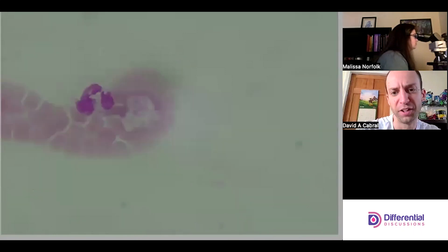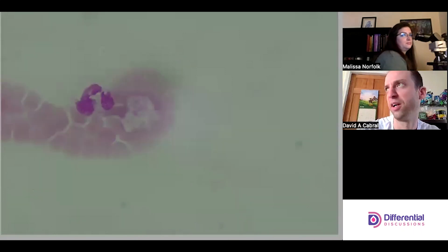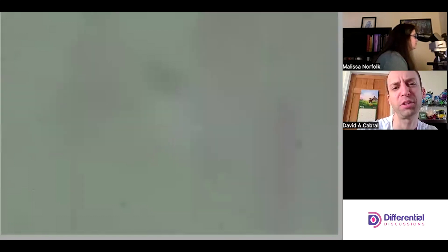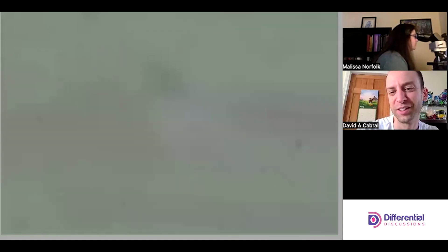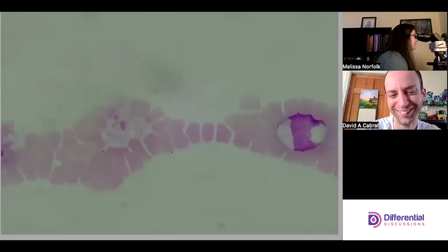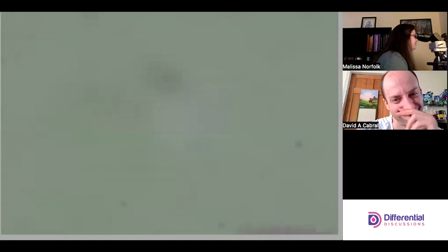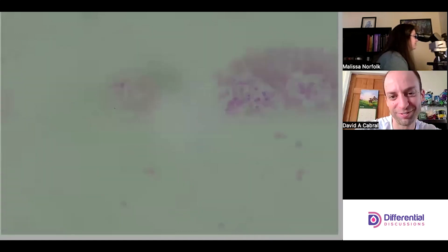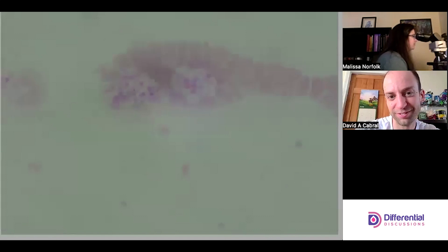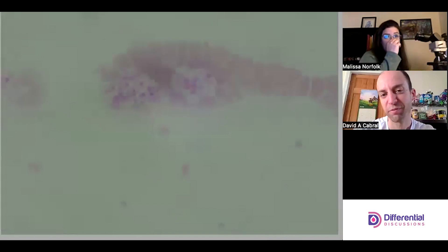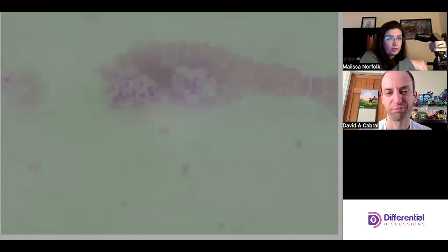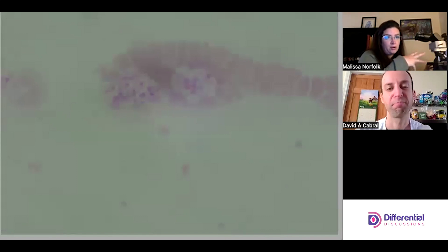There's a shape change and they're secreting stuff. There are a lot of them here, and because this is from a poor blood draw they're all clumped together.